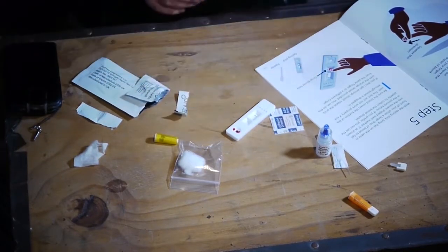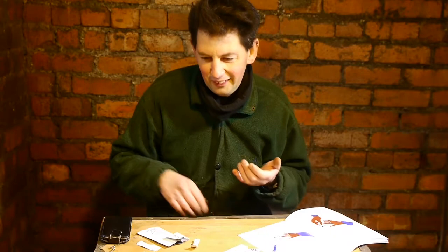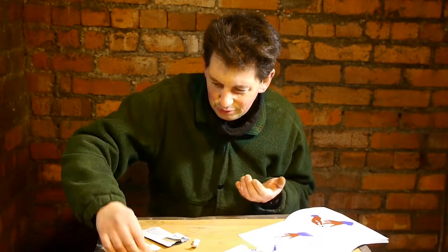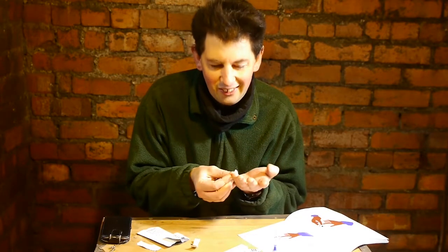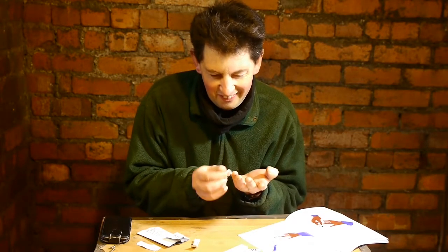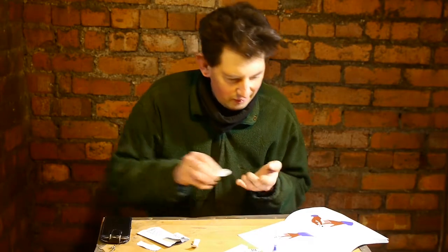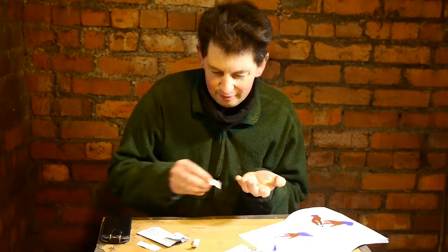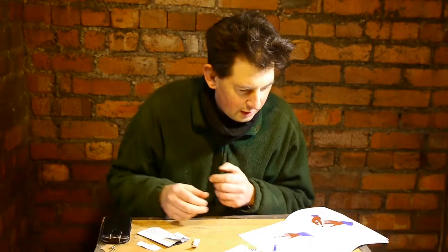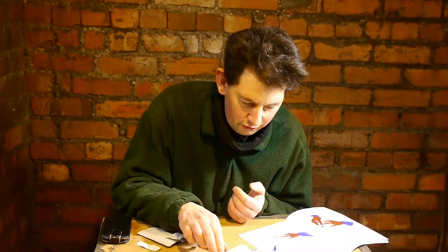Okay. I was going to lick my finger there, it wouldn't look good with it. Let's use this alcohol thing to wipe it off. I'm going to save the cotton wool till later for something else. I don't know what. Right, excellent. More blood's coming out now. Ugh. Blood. Right, testing stick on the table.